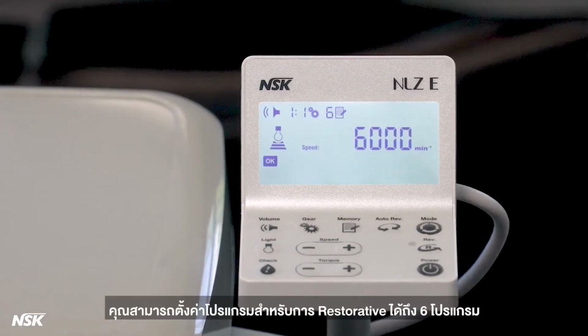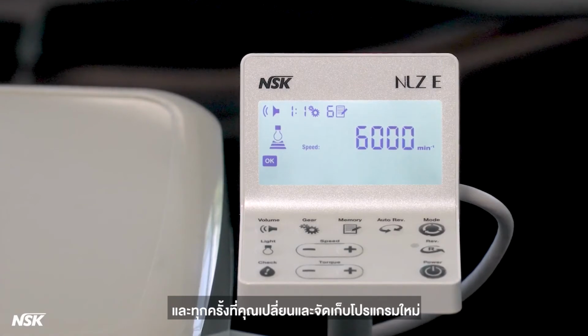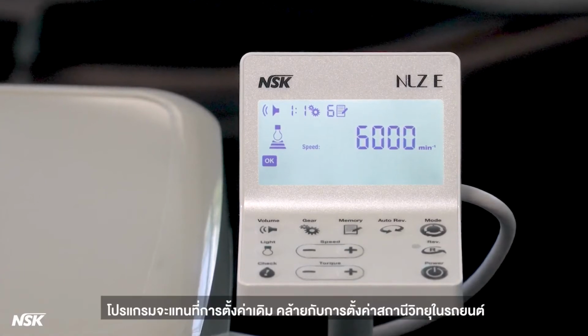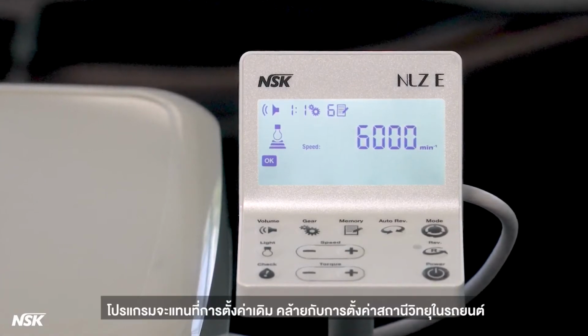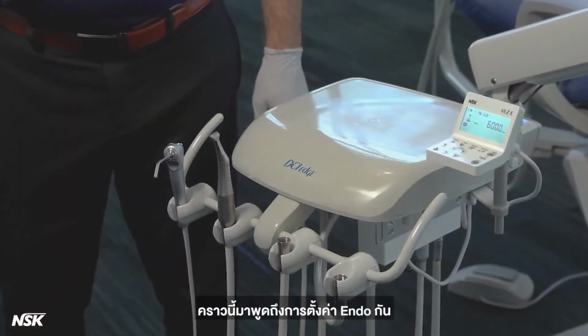To recap, you can set up to 6 programs for Restorative, and anytime you change and store a new program, it will replace the old settings. This is similar to setting a radio station in a car. Now, let's talk about Endo Settings.